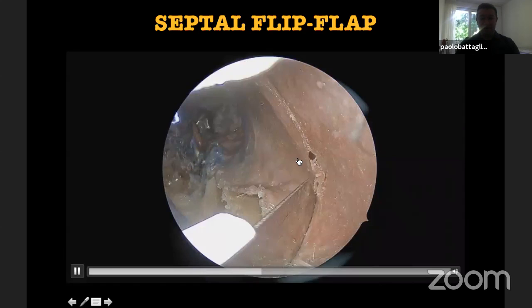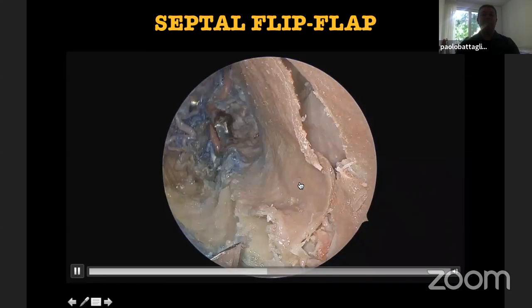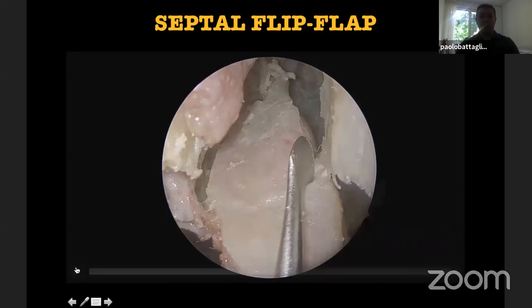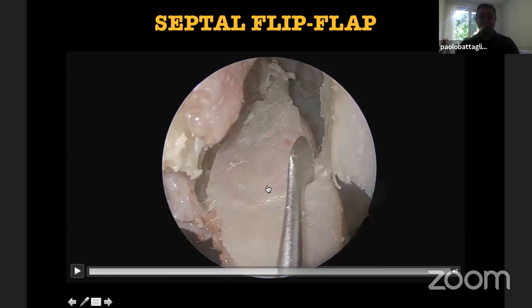Then here, the anterior incision of the flip flap is anterior, of course, to the posterior wall of the frontal sinus. As you can see here, at the posterior wall of the frontal sinus, you don't have to go down straight, but you have to come anterior and then down, because when you flip the flap, it will have to cover the anterior part of the anterior skull base. So one trick that I suggest is to expose the posterior wall of the frontal sinus, remove the crista, as we show you in live surgery, and then not go straight down, but come anterior toward the anterior part of the nasal septum, anterior to the axilla of the middle turbinate. In such a way, you will flip the flap and cover the anterior border of the defect.